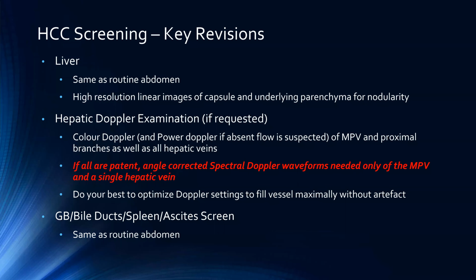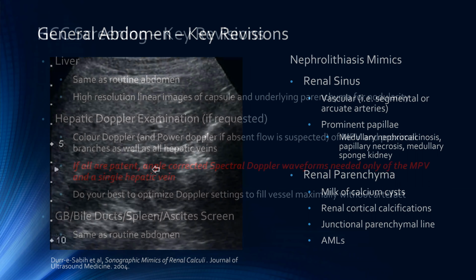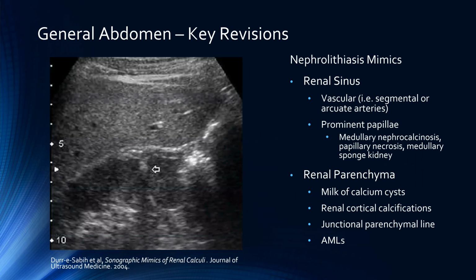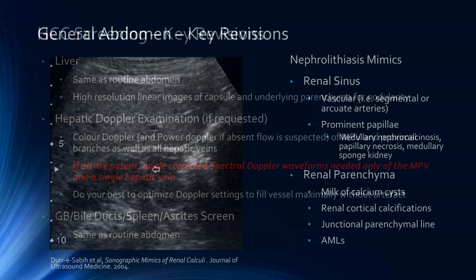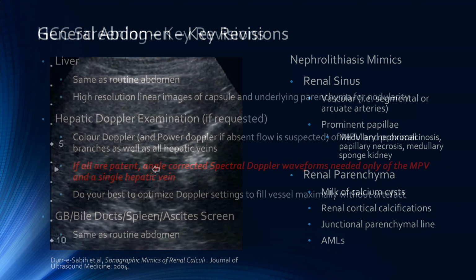So that's essentially it. I think we missed the spleen and left upper quadrant structures, but for the most part, this is just a transverse and sagittal image of the spleen as well as the splenic hilum, without and with color Doppler images, and then a general ascites screen of the lower quadrants that should also be included, and that pretty much wraps up the general abdomen.